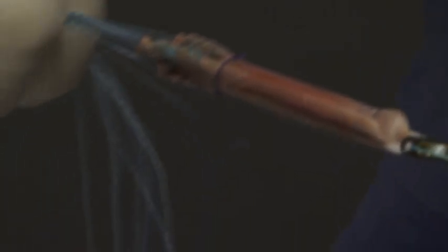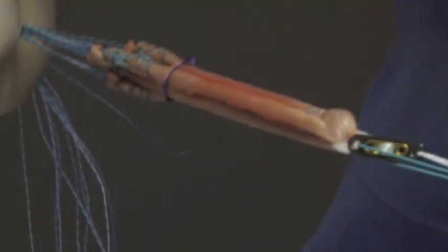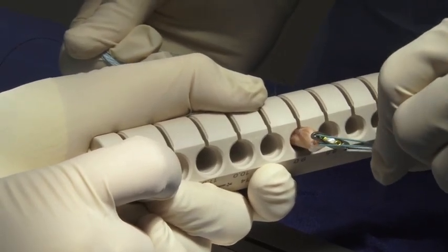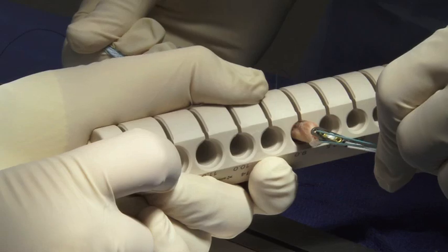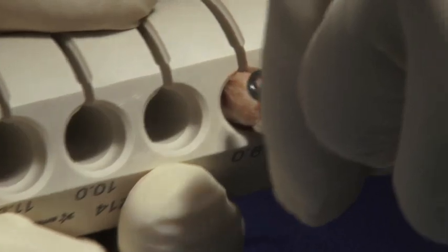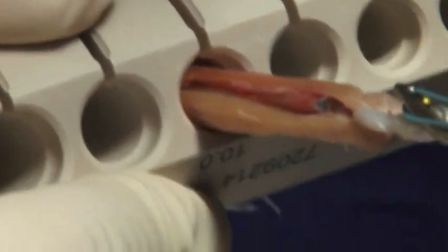The graft is then sized for its tunnel one final time, with usually the tibial tunnel being one millimeter larger than the femoral side.